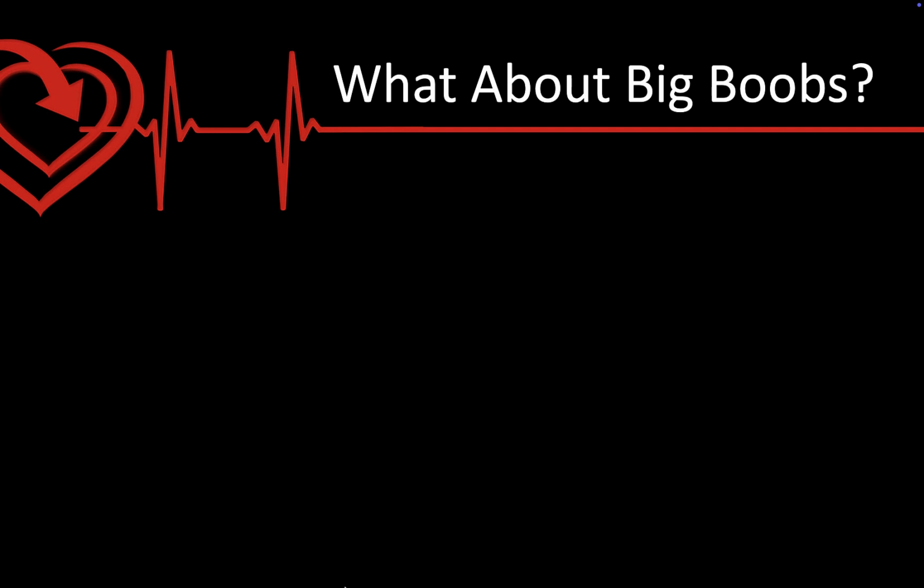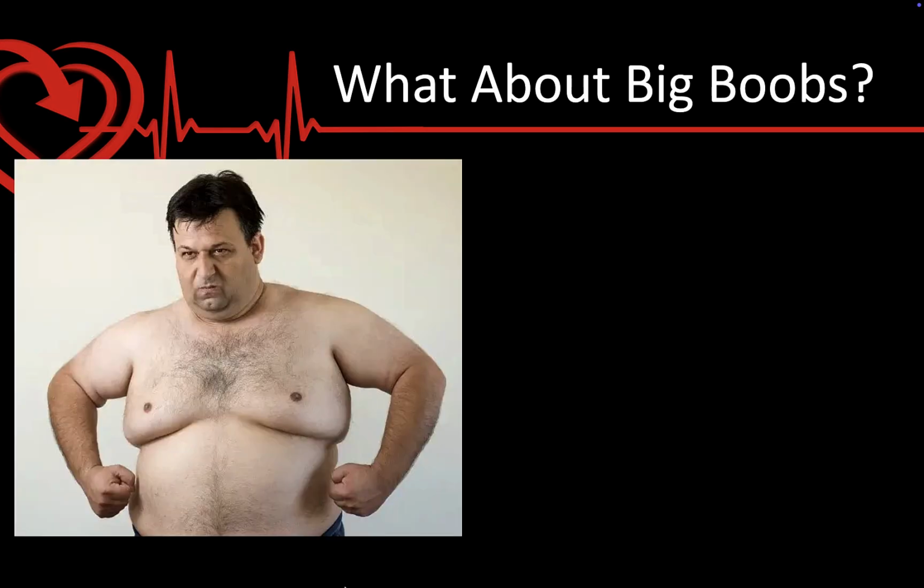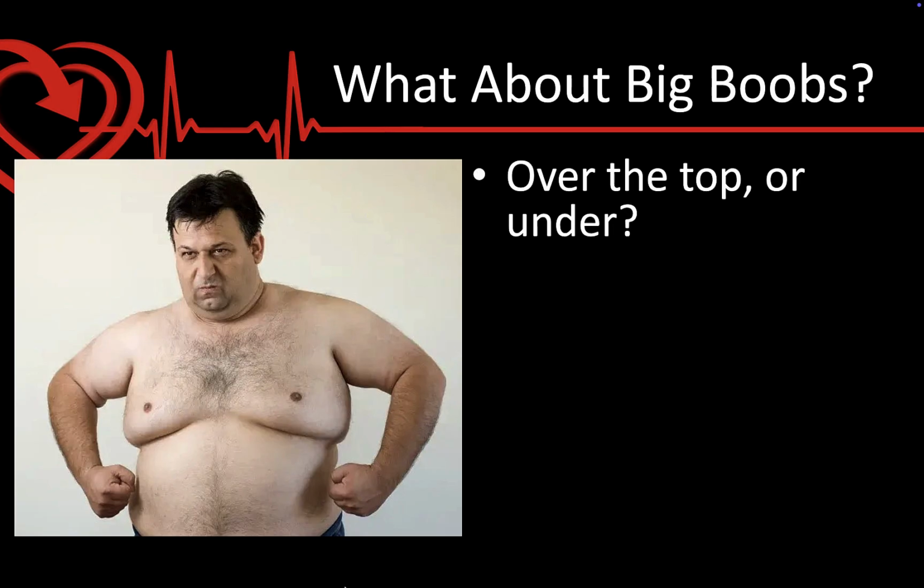Well, what about a patient with big breasts? We obviously have patients where the anatomy of our patient is going to make it more challenging to make those placements look like they do in some of those pictures. Whether that's a man or a woman, the challenge is getting it placed appropriately. And the question comes up, do we go over the top of the breast?